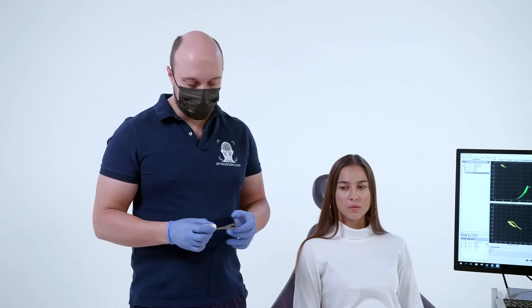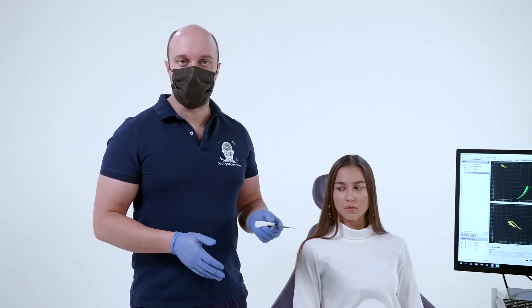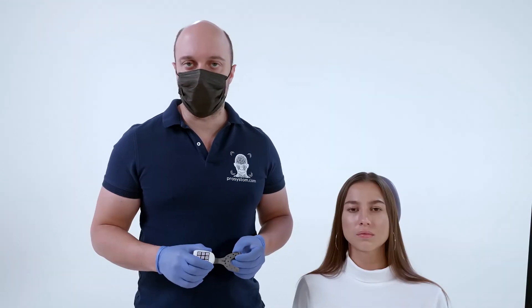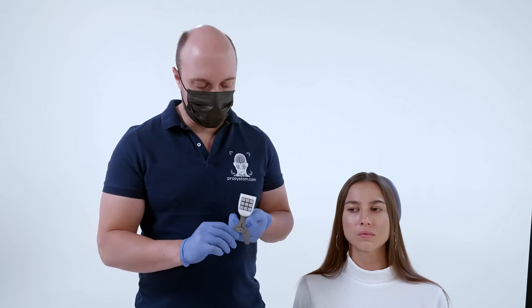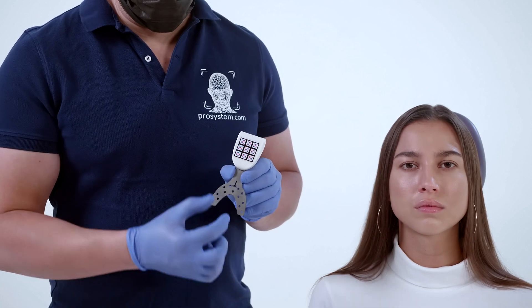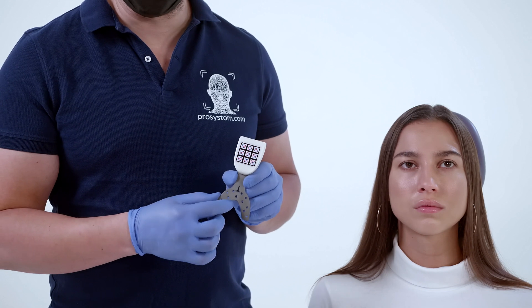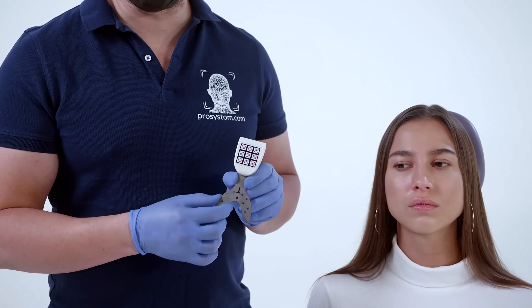It is specifically designed to transfer information to virtual articulators. For precise positioning of the bite fork, we apply a silicone register on it. There is a special mark on the fork for the dentition — according to this mark, the incisor teeth of the upper jaw are positioned.